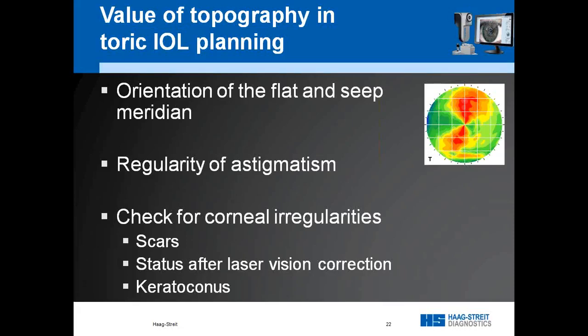He just simply forgot about that. And we can even look at keratoconus, but as said before, you only see the central 6 millimeters, so if you have a keratoconus suspect, you might see it at the lower edge of topography, and then you would go and ask for a fully scaled topography to double check the keratoconus status.